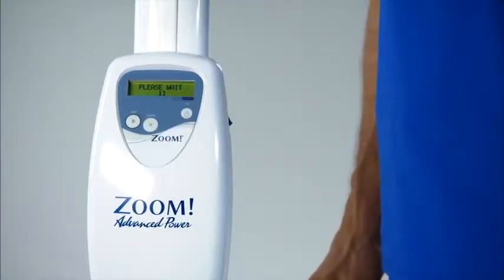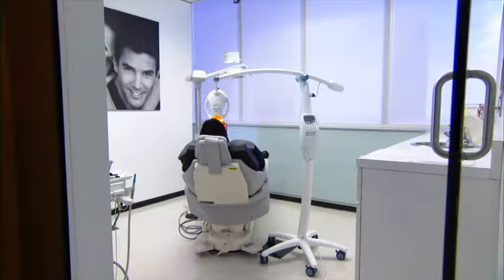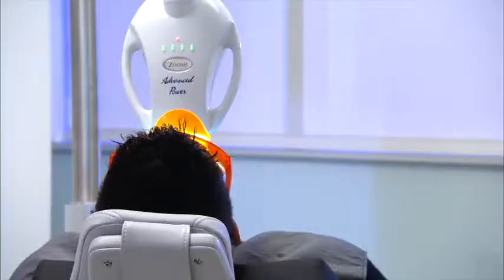The lamp will beep once when 3 minutes are remaining and again 3 times just before the session ends. When the time reaches 0, the light will turn off and a long beep will sound.